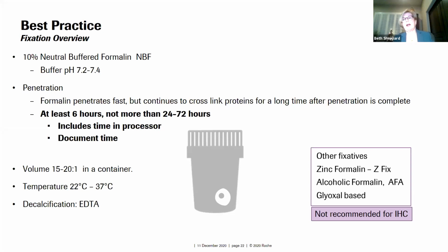And I want to also point out that there are other fixatives that we have to worry about that are not recommended for IHC, and I'll show you a sample of that in a moment. But also decalcification can cause issues with RNA and DNA, especially when you're doing immunohistochemistry, and the recommended decalcification is EDTA.